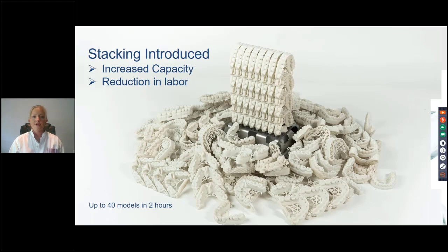It really helps because you don't have to keep going and cleaning it and things like that. And in an office, you're probably going to have your assistant run it, so she doesn't have time to go back every 30 minutes sometimes. So we can do a quick turnaround, or a 2-hour turnaround. This would take about 2 hours to print, so every 2 hours, or it's good for an overnight build as well.